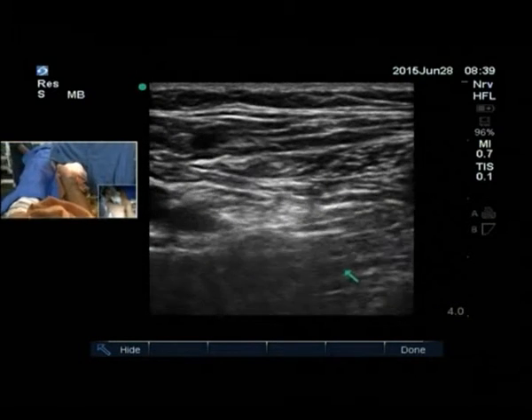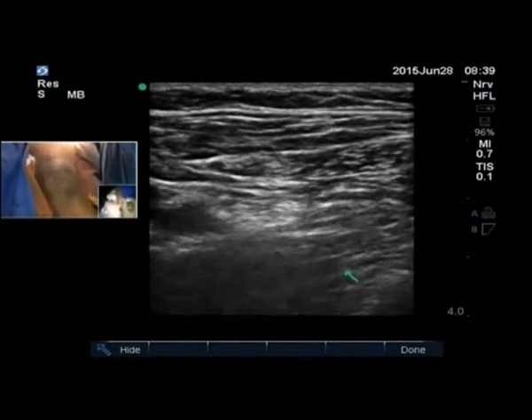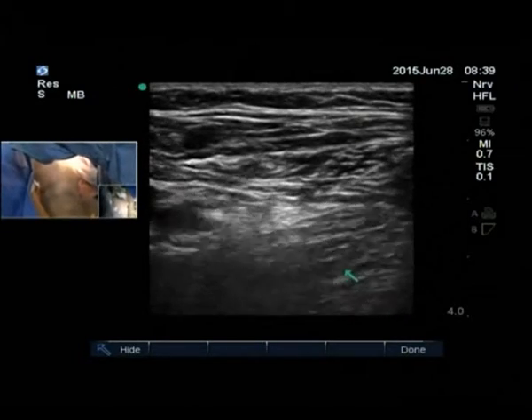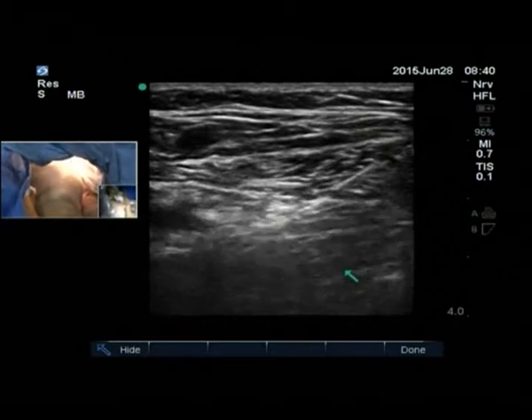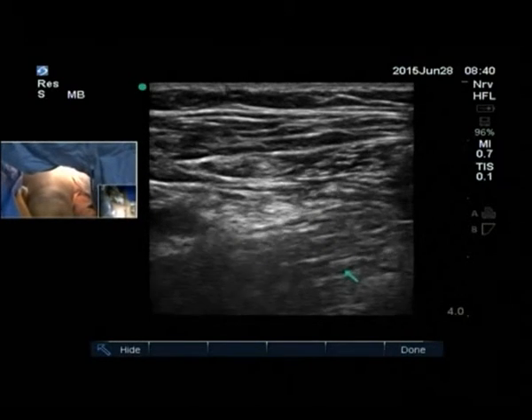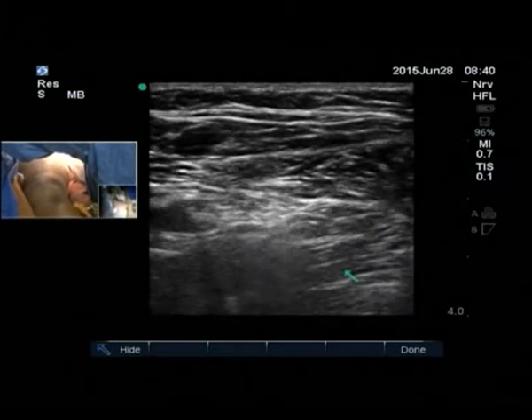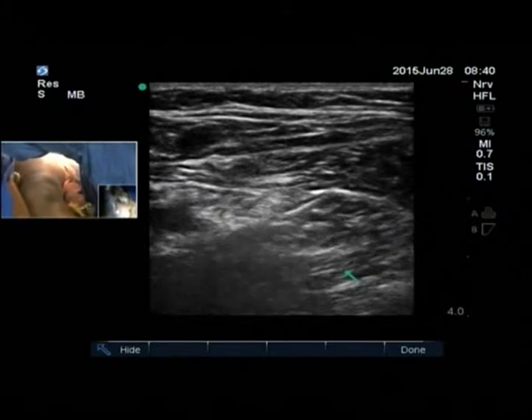We are stimulating, and you can see the twitch. Can you focus more on the quadriceps? See the needle. Can you see the contractions now? Yes, now it's seen well. Okay, let's decrease it, and then I think we can do a test now. Again, what I really want to see is a spreading. Can I have half a cc? Okay, so again, I am half into the muscle a little bit. I'm pulling back. Okay, half cc there.